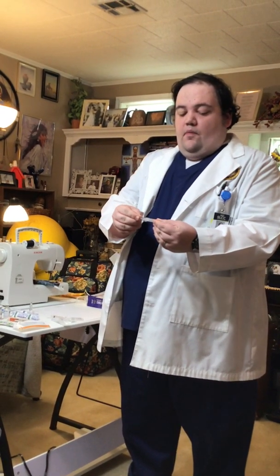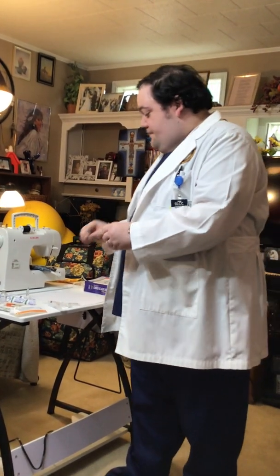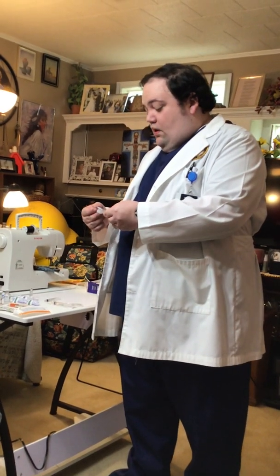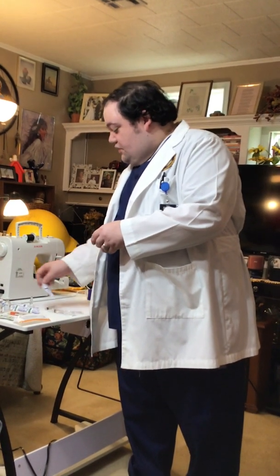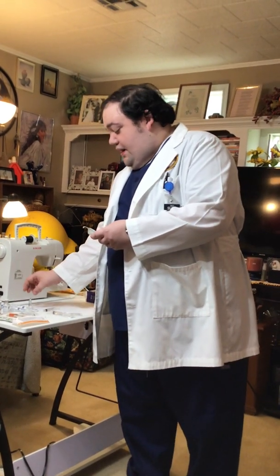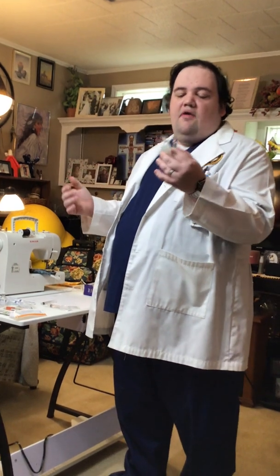Just the tip. Work it loose. All right, we still have sterility. And because this is a glass ampule, when we break the glass off, some of it is going to fall, may or may not fall into the liquid. I don't know, I can't verify that.